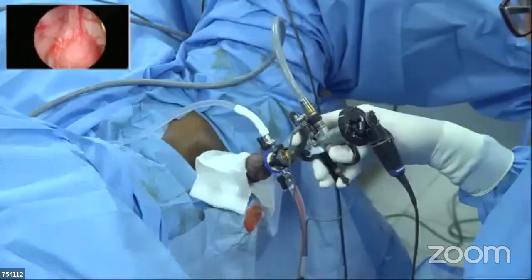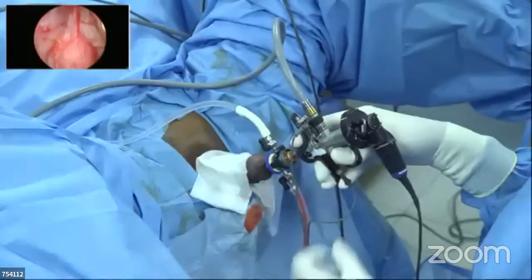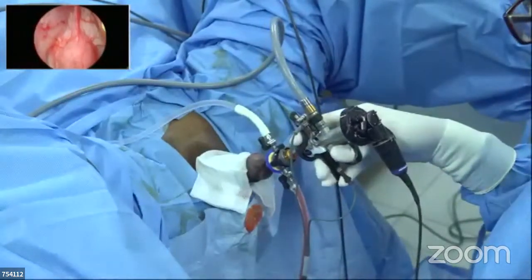Can we have the PIP the other way around? Larger endoscopic view and a smaller surface view.